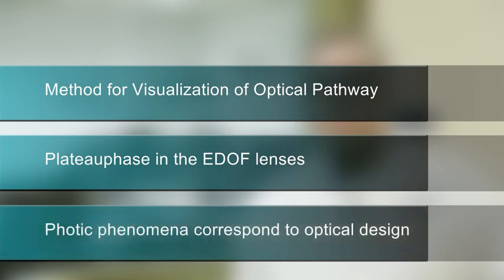The translation into daily dysphotopsias could also be visualized with a halo and glare simulator, showing more classical halo type for the RayOne and the FineVision lens, but more starburst-like dysphotopsias with the PanOptix and the Symfony lens. In general, the EDOF lens showed lower intensity of dysphotopsias.